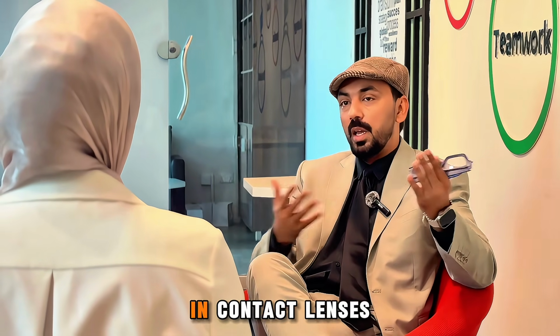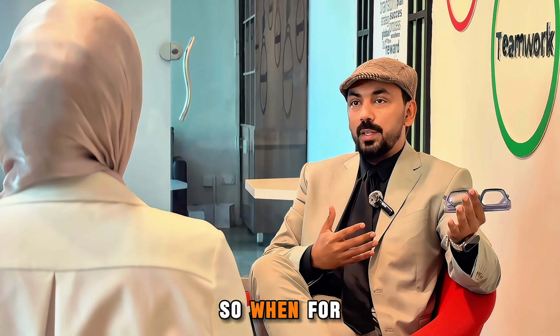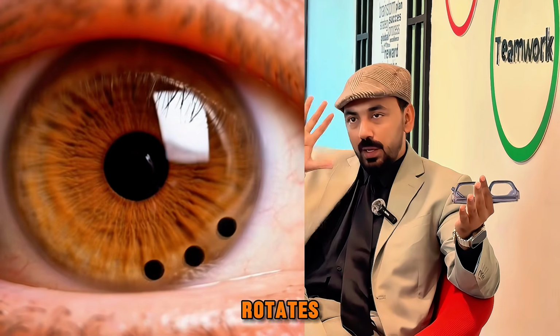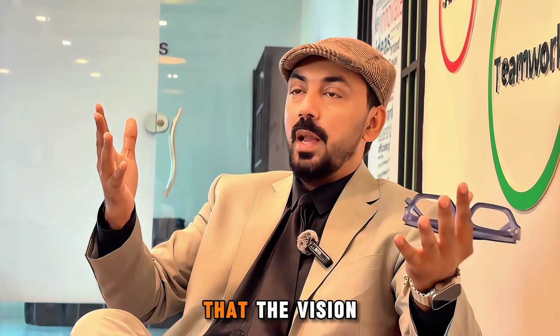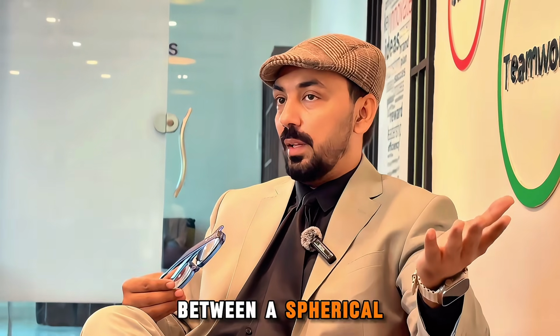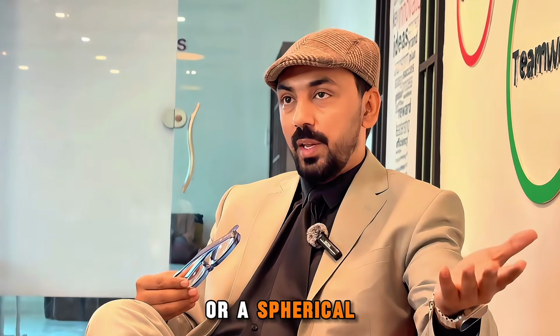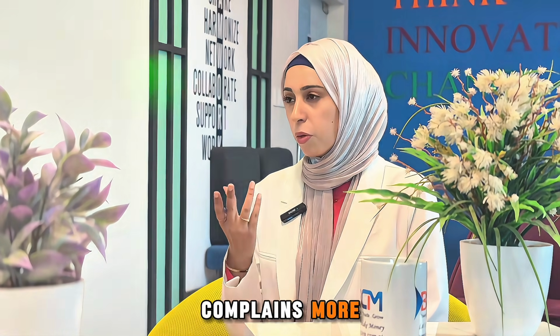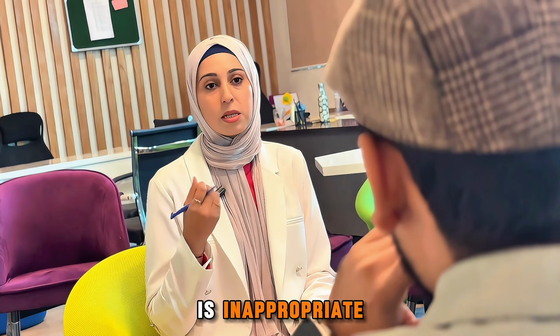So the same applies in contact lenses, right? If I blink and with my blinking the contact lens rotates, the axis will be rotated. And if the axis rotates, you know that the vision will get blurred. So this is the main difference between a spherical lens and a toric or cylindrical lens. Sir, why do astigmatic contact lens patients complain more when the soft toric contact lens fitting is inappropriate?